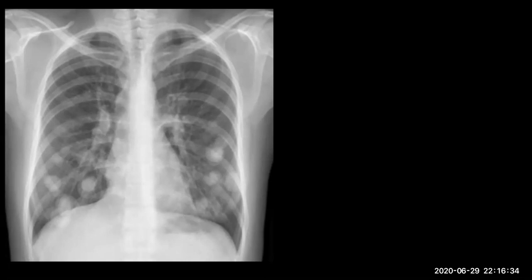Multiple AVM. How many multiple AVM do you see in your life? Too much? No. Okay, what other metastases can cause this? Other than the breast? GIT, colon, RCC possible, okay. Ovarian, it is male. Endometrial, but this is male. Okay, prostate. What other differential?